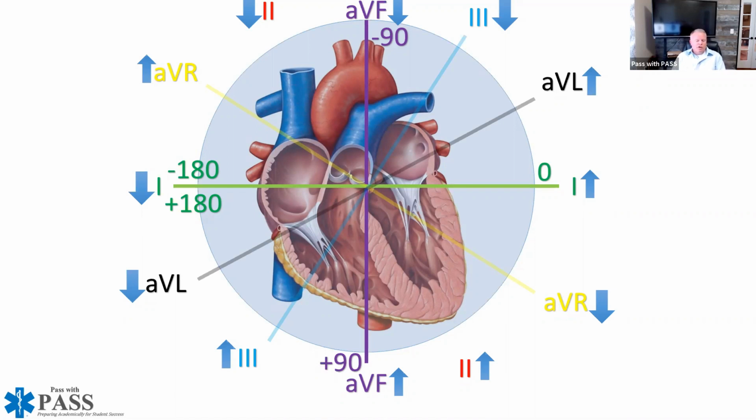If I'm looking at the 4 original lines that I put in, remember that lead 1 is going to go from 0 to a positive 180 degrees. The halfway point of that is positive 90. Incidentally, where the 0 is at, down to 90, encompasses which one of the chambers of the heart?